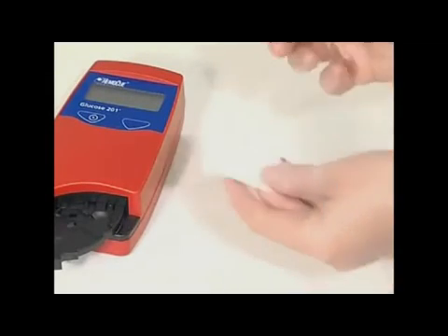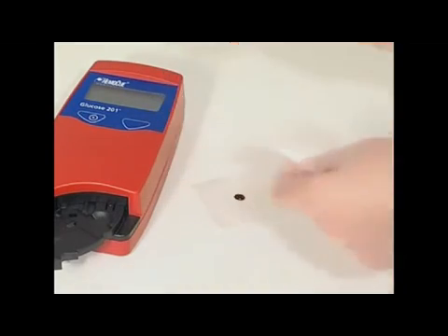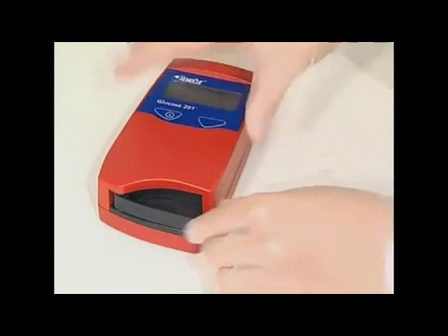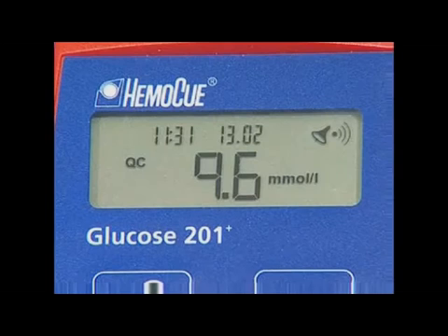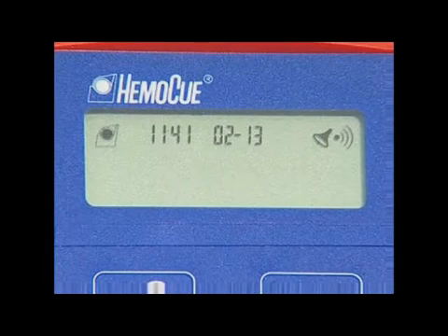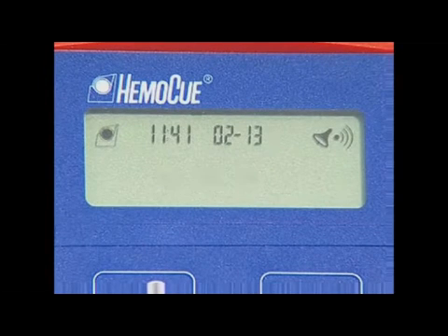Fill the micro cuvette with the control solution and carry out the measurement. Once the measurement has been made, the analyzer automatically returns to the measuring position and the QC symbol disappears from the display. Patient sampling can begin.